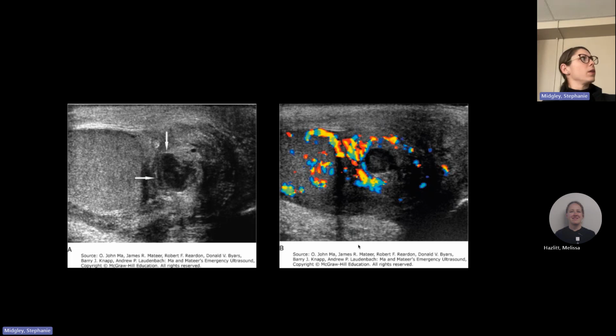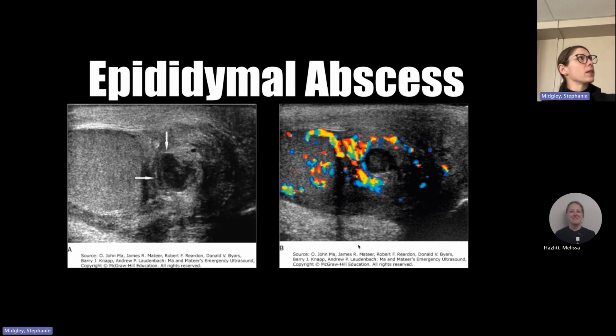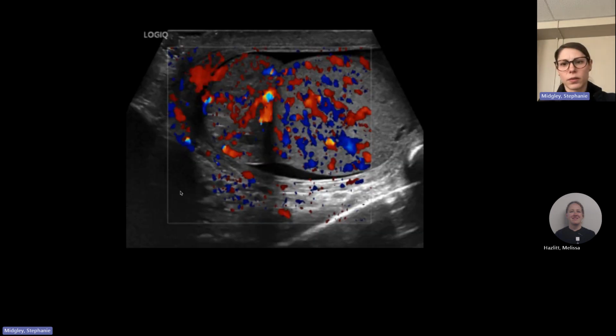All right, what do we think we have here? Yeah, exactly. What made you think abscess? No flow within it. You a little posterior? No blood flow within the actual hypoechoic area. Yep. And then in here, you see there's kind of mixed echogenicity changes as well.